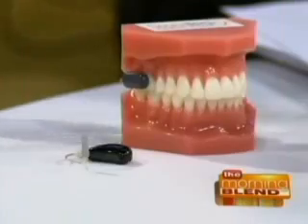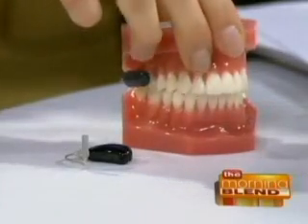So how do you fix it? What do you do with single ear deafness? Yep. What we have is for single ear deafness when you do have a nerve that's still really good. This is a device, I'll admit I was a little skeptical when we first looked at it, because as far as audiology and ENT goes, it's wearing your hearing aid in your mouth. I was like, really? Do they know we've studied this? No, this is very new. But I've got a replica here of what it looks like.